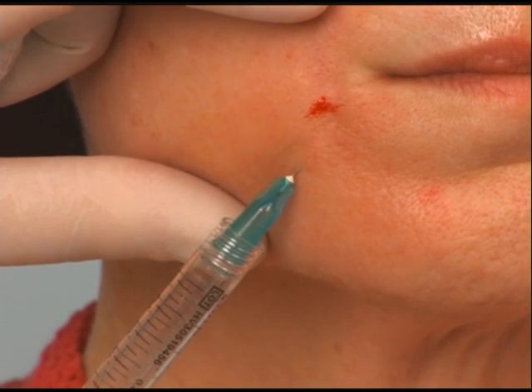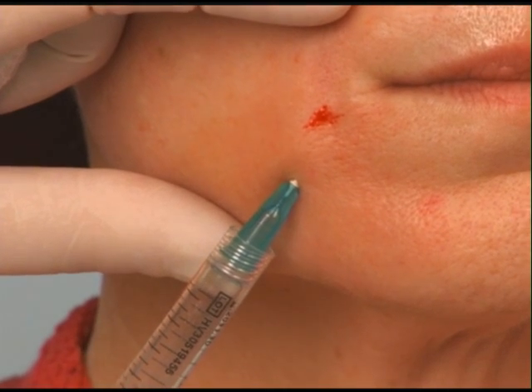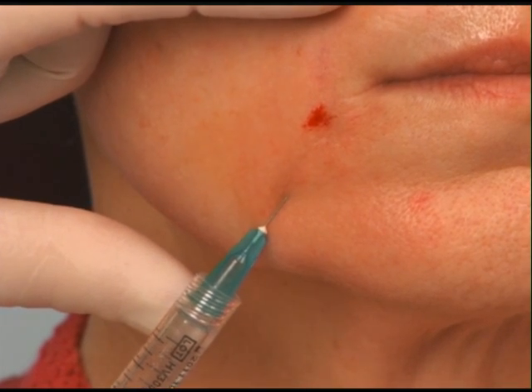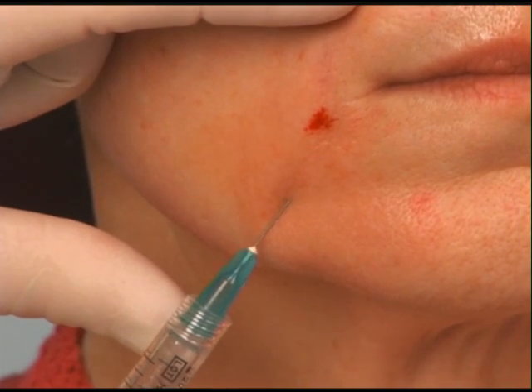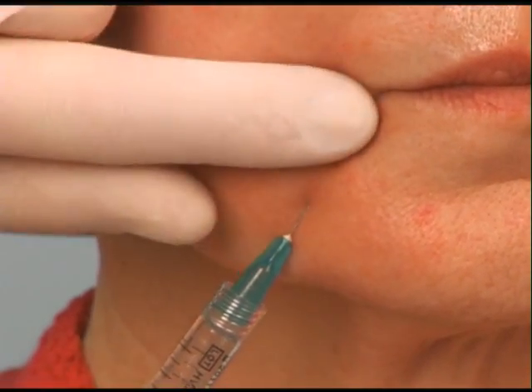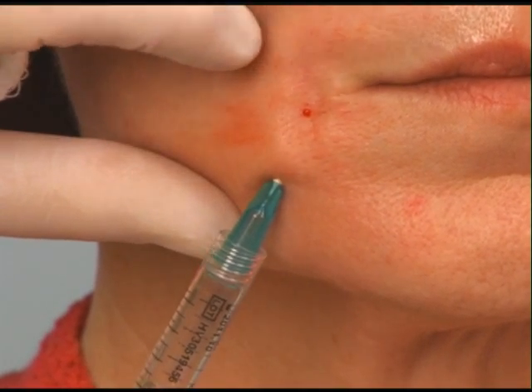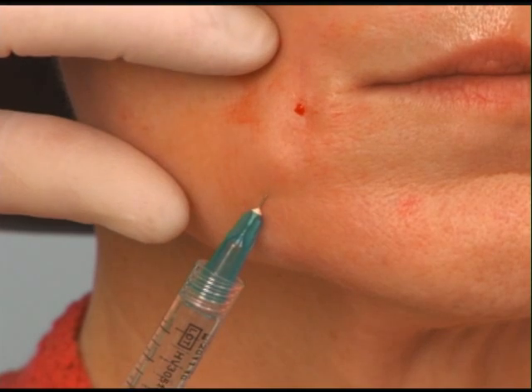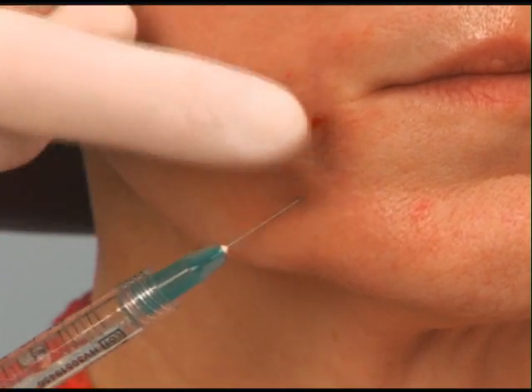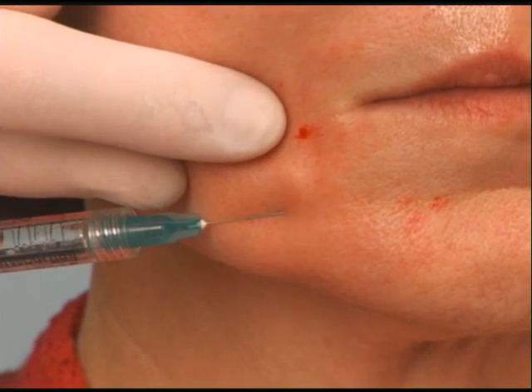I'm pretty deep. This might be a little stingy up there if it's not numb from the other injection. I'm going to inject as I come back — probably more than I inject as I go in. Then I'll go back up and do another little line right next to it, and redirect a little bit to get this little depression that comes across the chin from the same puncture.